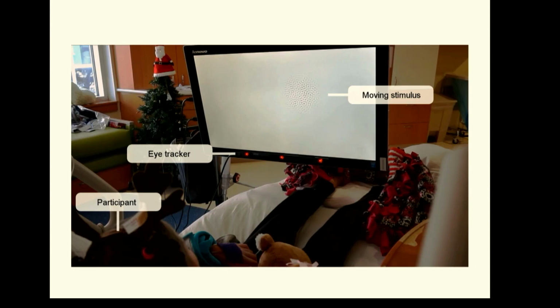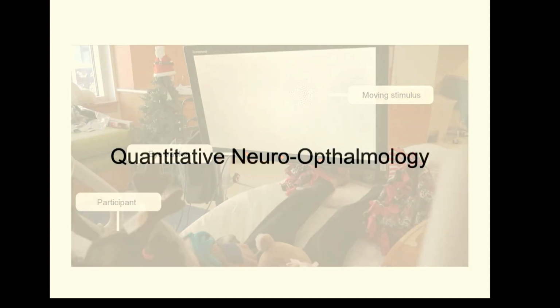There's a computer monitor. We put information on a screen. We move that information. We track eye movements relative to that information. And there's a child. This is a child. Obviously, it's Christmas season at Blythedale Children's Hospital, looking at this. I can go into a lot of details about why and how it's come to what it is, but you can see it's quite simple. And kids are looking at video monitors a lot in these situations anyway.